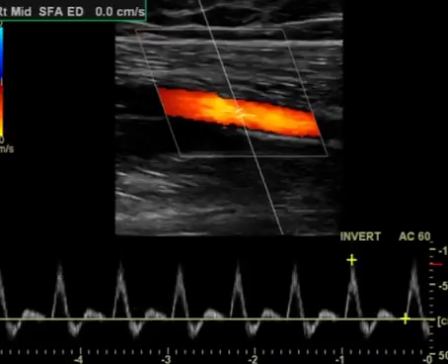What happens is that bolus of systolic flow is delivered down to the vessel, where at the end of the arterial tree there are the high resistance arterioles. Normally the arterioles are under vasomotor tone, so that there is resistance applied to that circuit. So what happens is this flow goes down, hits those arterioles, and then comes back. It gets kicked back as this wave right here, reflected back. It's called the reflected wave or the reverse wave component, that we see in early diastole.